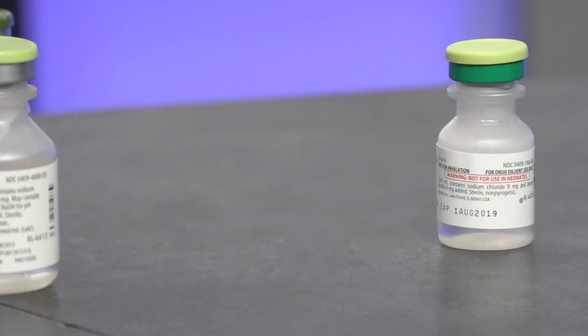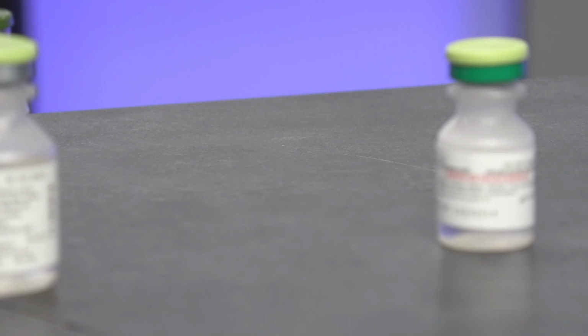So the bubbles, what this is producing, that doesn't exist. It automatically just comes back together to an air bubble. And again, you see in the syringe why the air is upwards. So this is why you definitely want to inject upwards, not downwards, when you're injecting into the patient's arm. So these are my fancy bubbles. And again, the syringe, make sure it's locked.